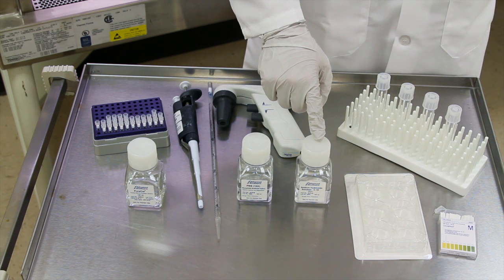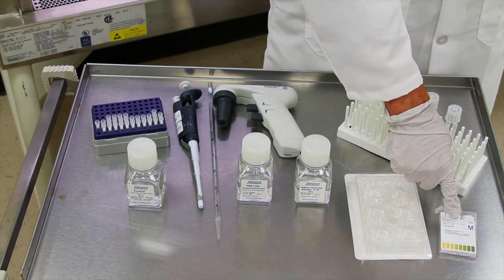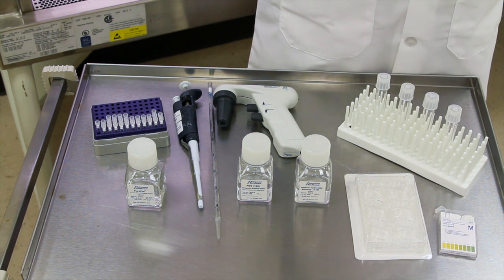You will also need 0.1 molar sodium hydroxide, cell culture ware such as flasks, dishes, or plates, a way to monitor pH level such as a pH meter or pH paper, water, a cell culture hood, and an incubator.